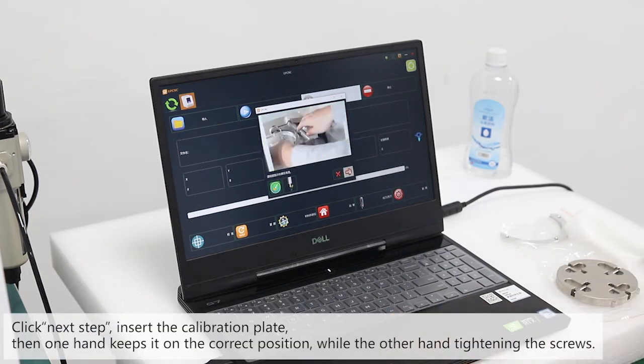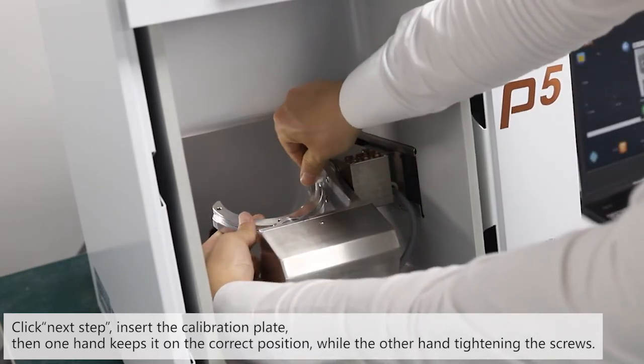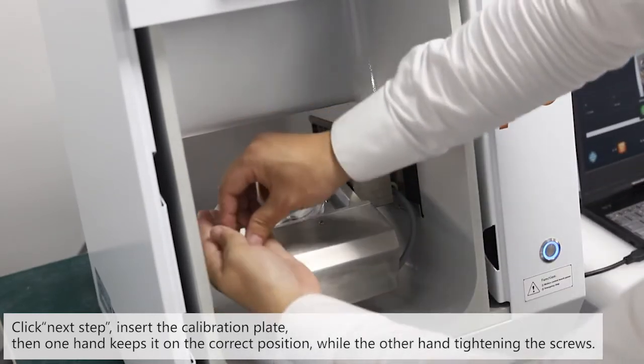Click next step. Insert the calibration plate. One hand keeps it in the correct position while the other hand tightens the screw.